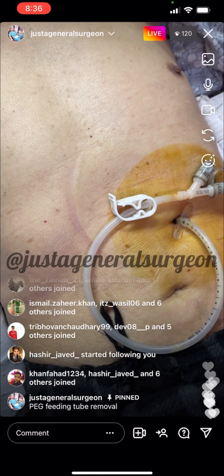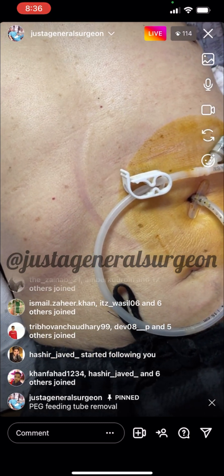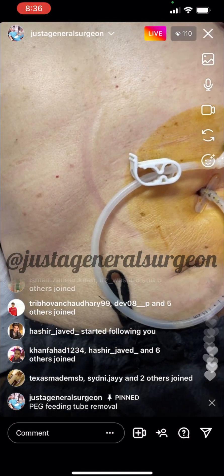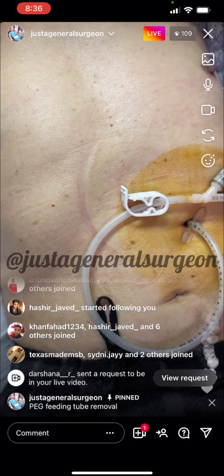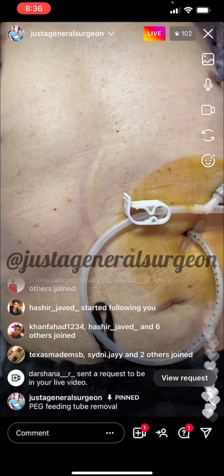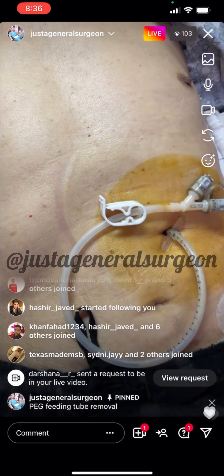He no longer needs his feeding tube, so we're going to remove it today. He's had it in for over a couple of months, so it's safe to remove. If it had been placed more recently, we would wait four to six weeks after PEG tube placement to allow the stomach to scar up to the abdominal wall — otherwise there's a risk of it falling away if removed too soon. But he's had this for several months, so the stomach is now securely attached to the abdominal wall.